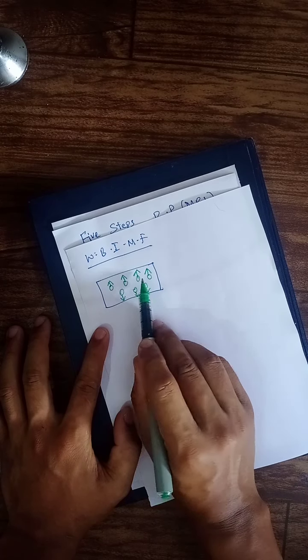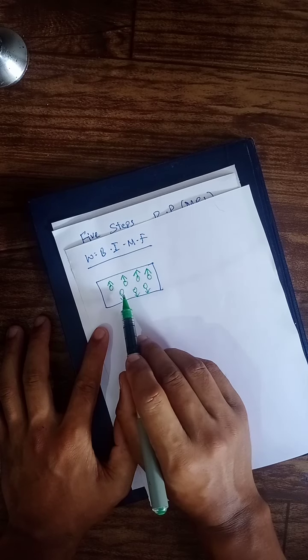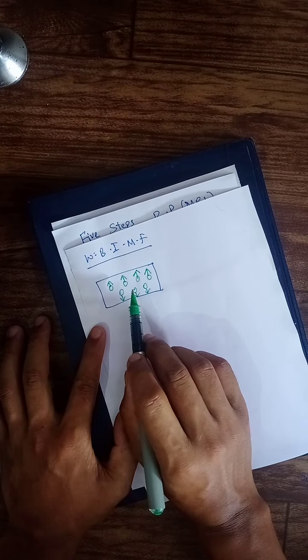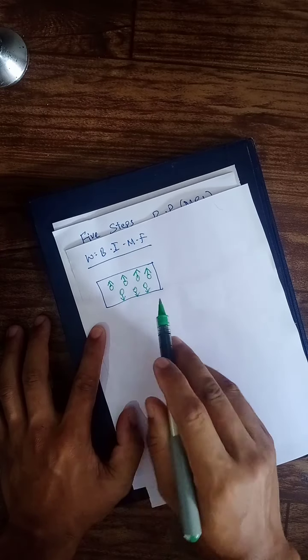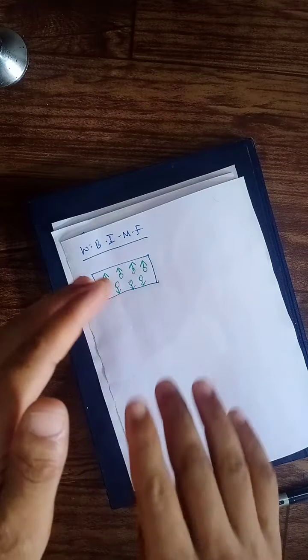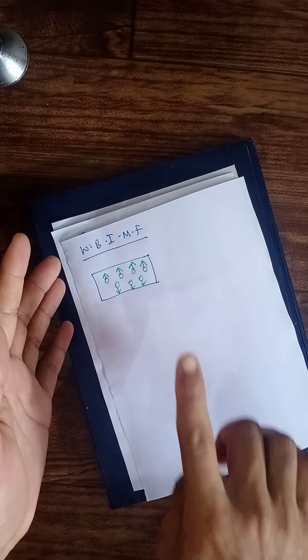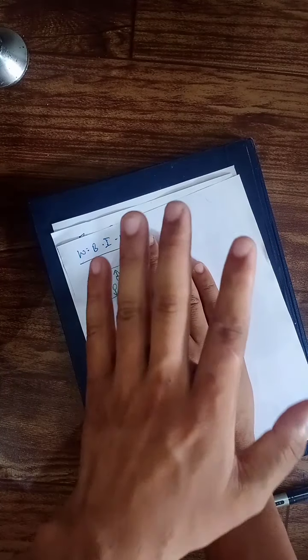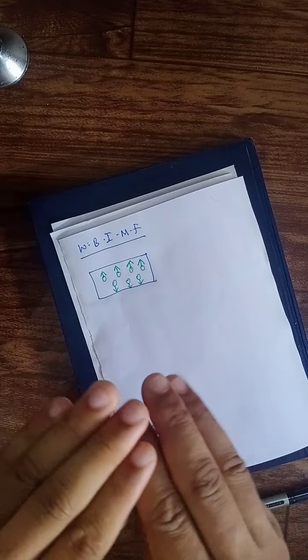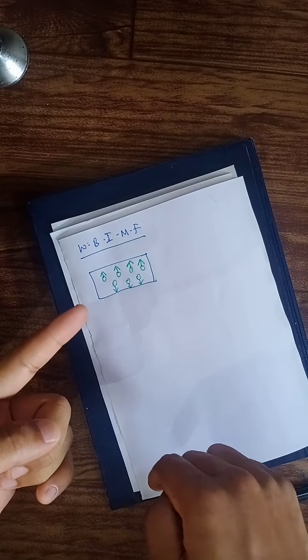In the parallel direction you'll find the majority of the protons. Can you understand a bit? So let's start. This is what happens when your body is placed inside the magnet or the MRI machine. When your body is inside the MRI machine, all the protons which were in random motion will be aligned either in parallel or anti-parallel.